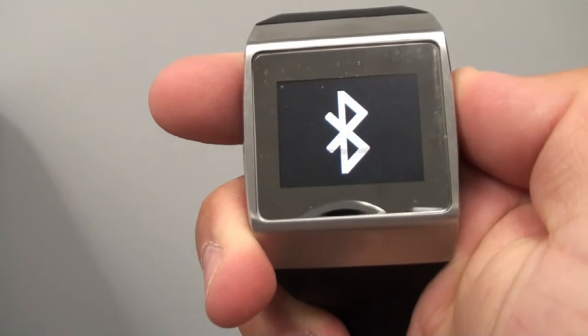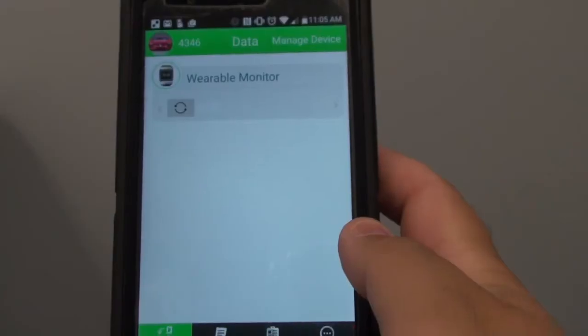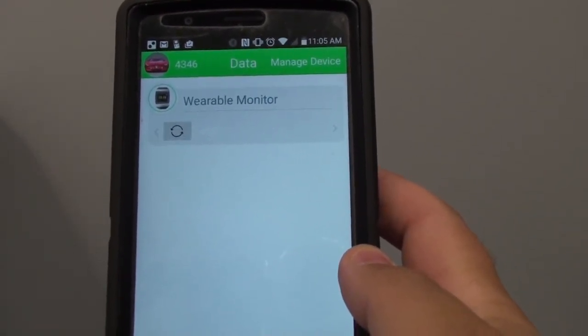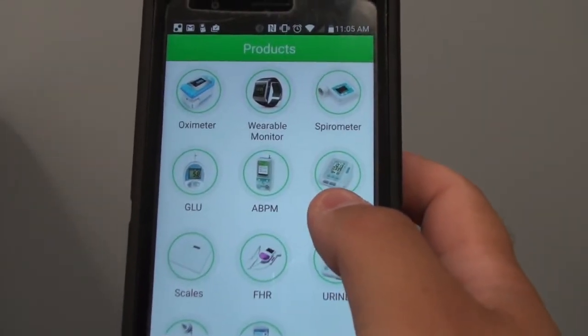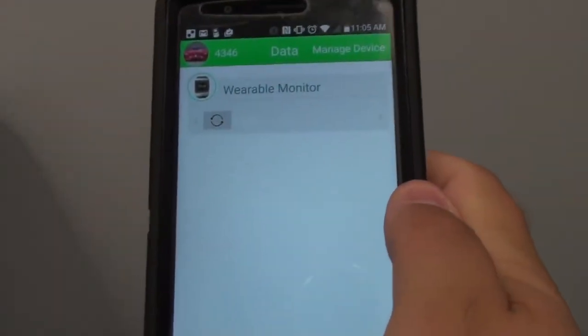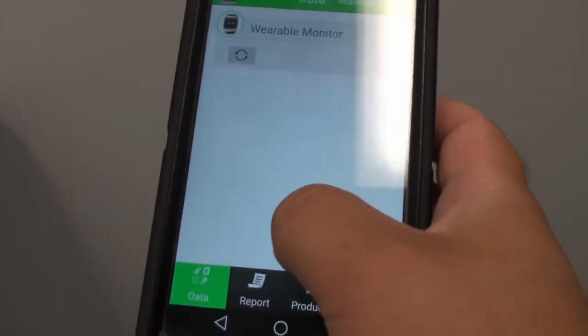The third button, pressing it in, will bring up the Bluetooth to sync it to the device. After setting up the application you'll be able to start using it. You can go to the products section and choose what device you want to sync. After syncing the device you'll be able to change the time and date and explore the device.